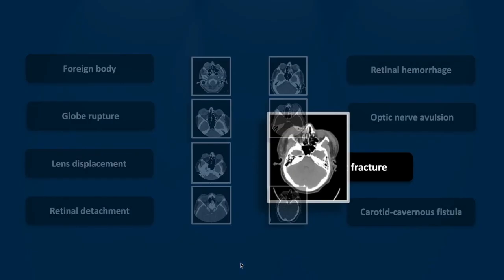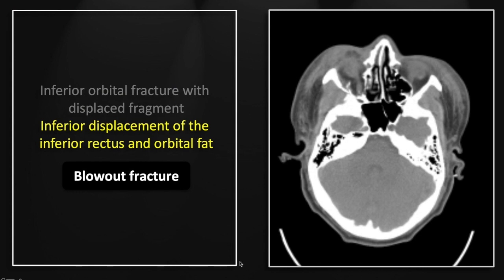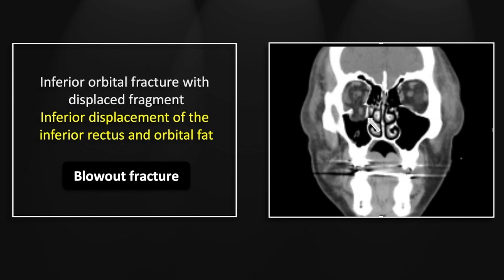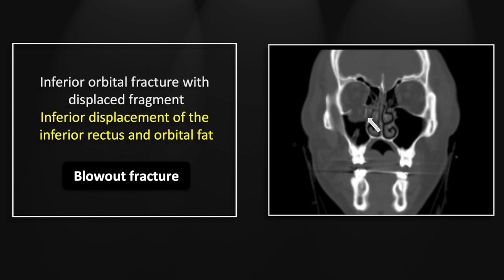The next case is an obligate case when dealing with orbit trauma: a straightforward blowout fracture. You can't rely on the axials — you can see disruption in the floor of the orbit and herniation of orbital fat into the sinus below, as well as herniation of the inferior rectus muscle. In the early days of CT the reformats were so poor we had to call these on the axials, but with good coronals available today that's no longer necessary. You can see the trapdoor displaced fragment from the orbital floor and herniation of the orbital fat and inferior rectus muscle.